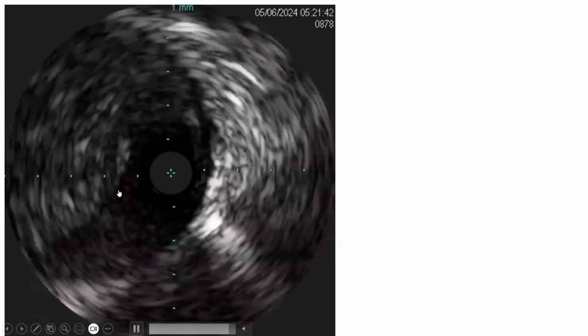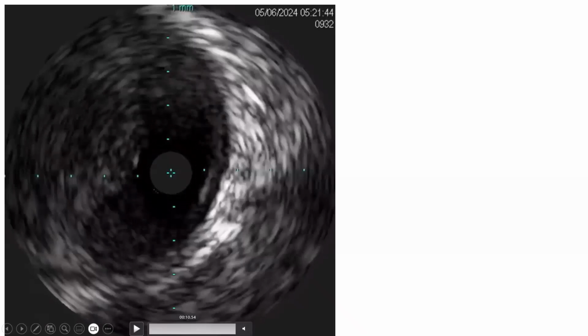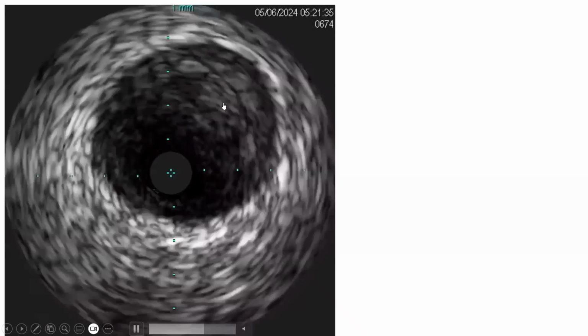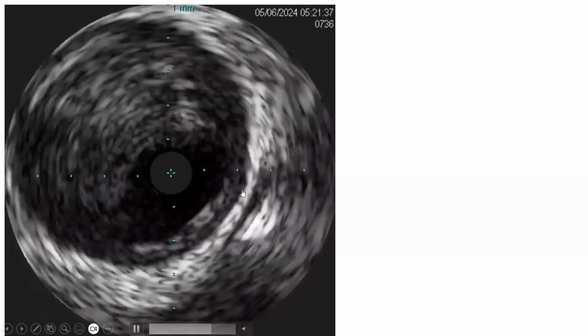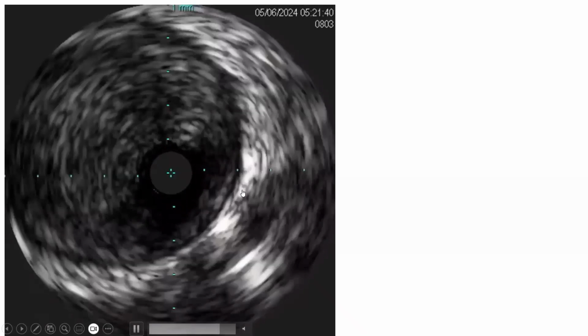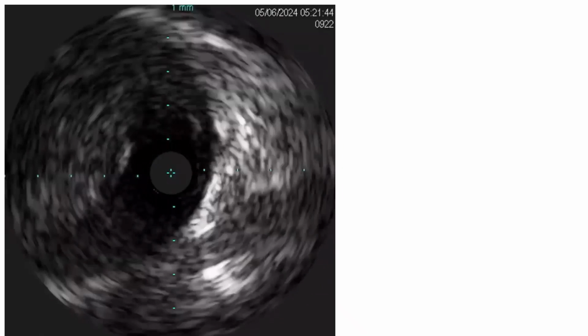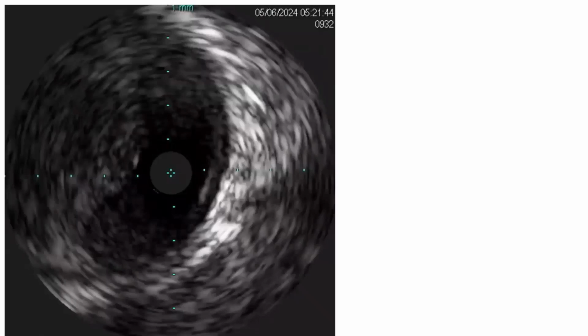And interestingly, you may see that this patient doesn't have a lot of plaque. He has a lot of thrombus, but not a lot of plaque, intimal plaque. Therefore, he has either plaque erosion on top of mild plaque, or he has what we call thrombosis in situ on top of very ectatic vessel with a mismatch between the proximal vessel and the caliber of the distal runoff.